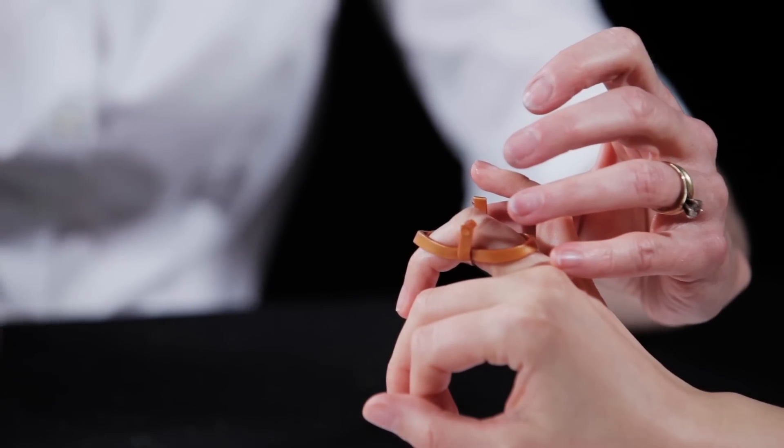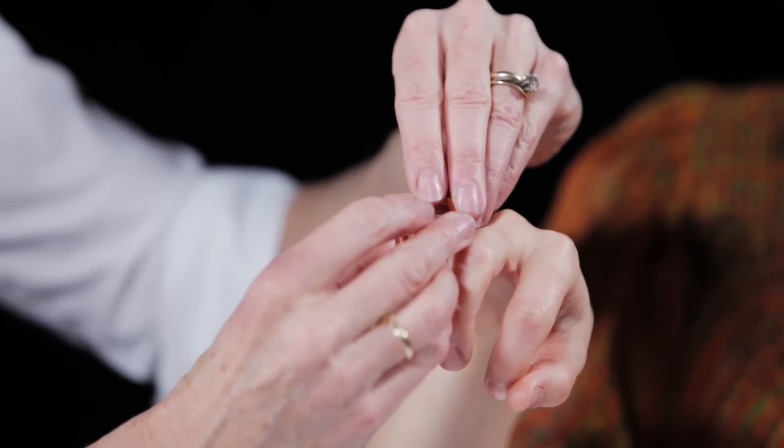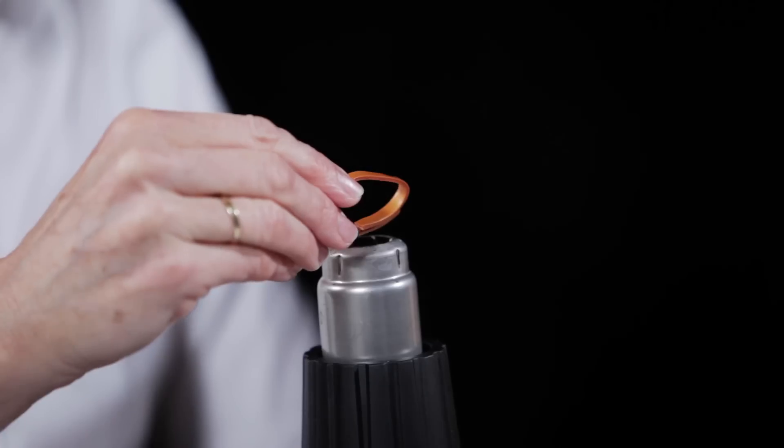Carefully remove the orthosis from the patient's finger. Due to the coating, these attachments are not secure. Using dry heat from the heat gun, carefully heat and press each end of the strip to firmly secure it in place.